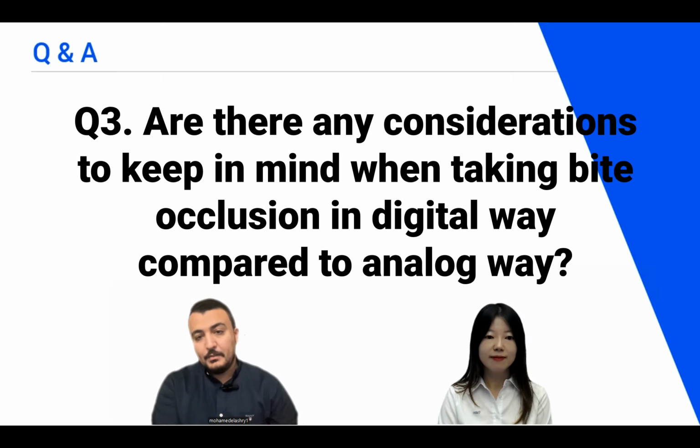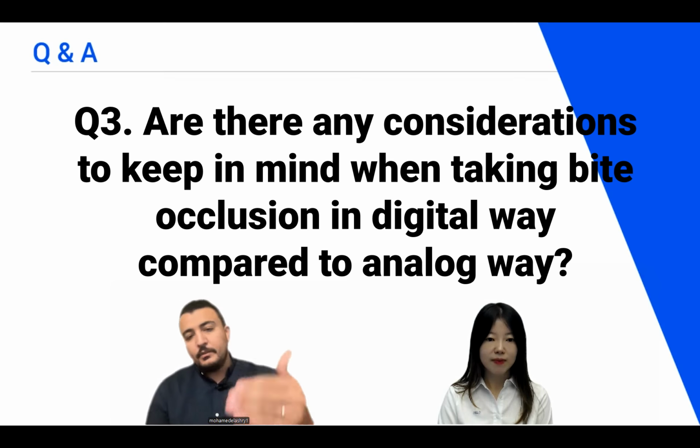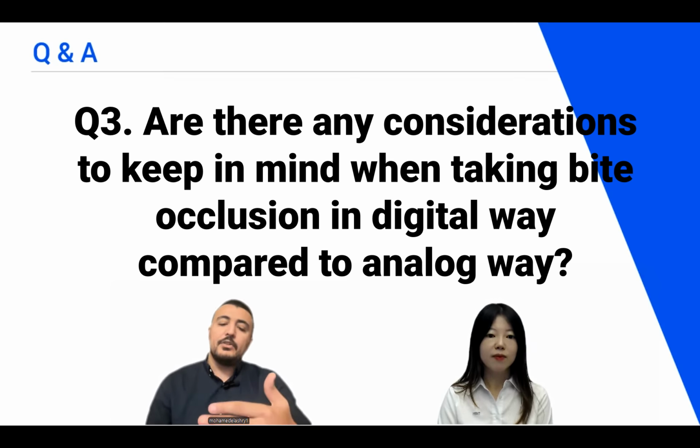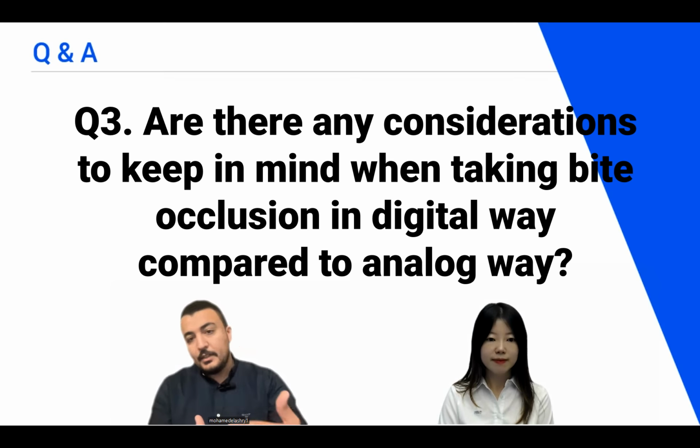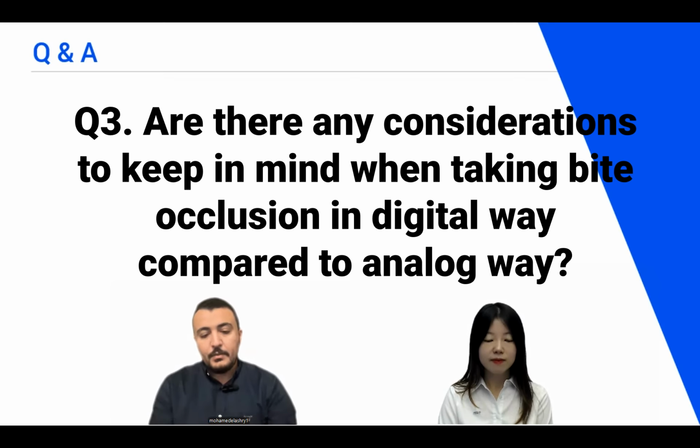So I placed a chart in the webinar of how we can customize the scheme for complete mouth rehabilitations to reach the ideal outcome, starting from the diagnosis, then moving to the analysis of the smile, and then recording vertical dimension. I also mentioned in the webinar what I think are the easiest techniques to make virtual mounting and virtual facebow transfer, and finally the design. So each step is very, very important for an ideal outcome regarding the occlusal contacts.